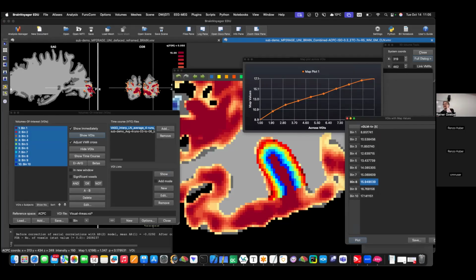It's also my drawing, and it's a bit different than Laney in that point. I should change that because normally I do not want the voxels outside gray matter, so it deletes those because it's not gray matter. But of course you want to see maybe a little bit how CSF and white matter look, so that you see a bit more of the fringe, right? At the time I programmed that quite restrictively and said you should only show me gray matter voxels, right? But sometimes it overcorrects there, so it's a little bit too sharp.